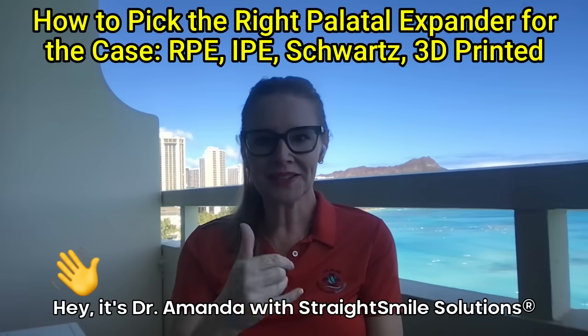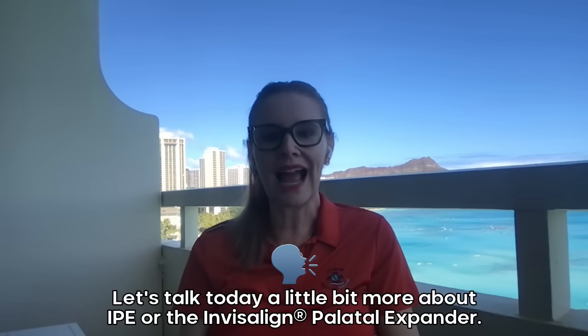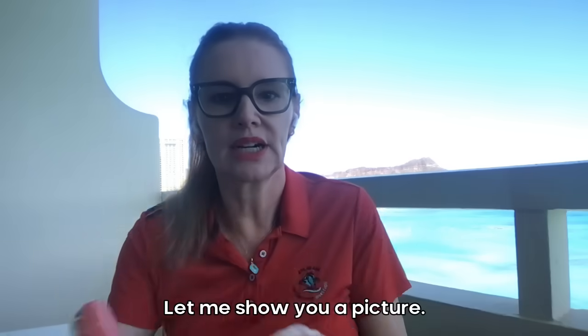Hey, it's Dr. Amanda with Straight Smile Solutions, straightsmilesolutions.com. Let's talk today a little bit more about Invisalign IPE, or the Invisalign Palatal Expander. Let me show you a picture.